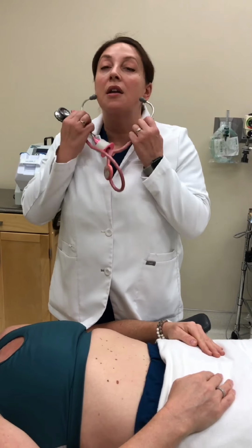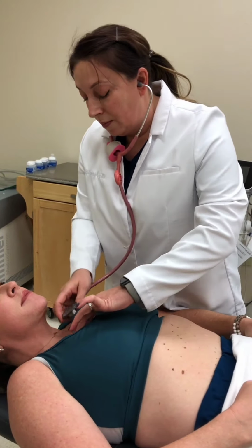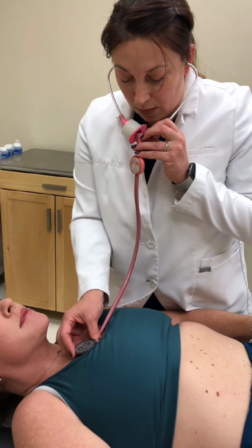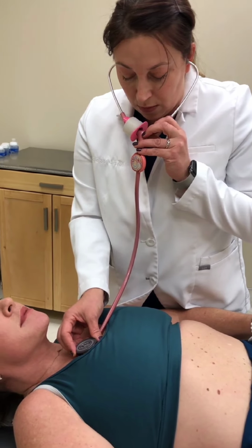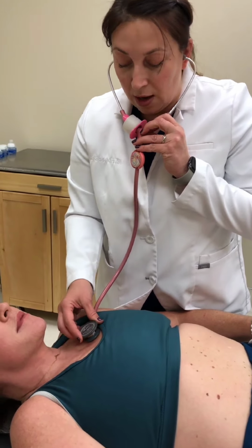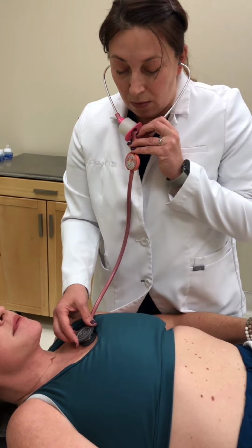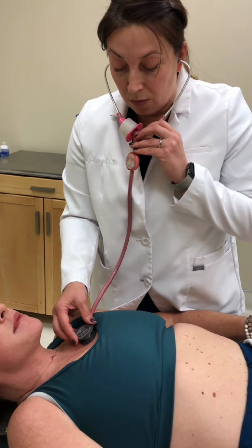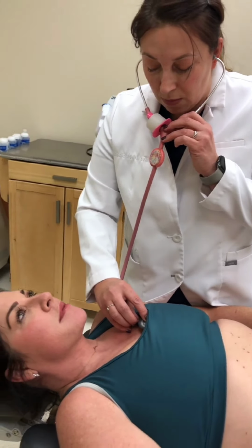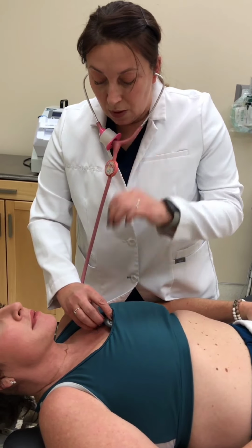And I'm going to turn and listen for murmurs, starting with pulmonic. Aortic. Erb's point. Good.